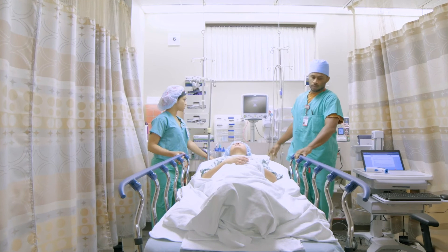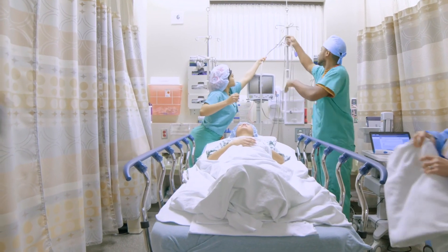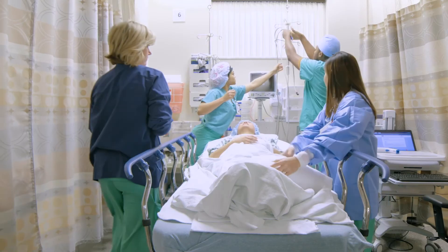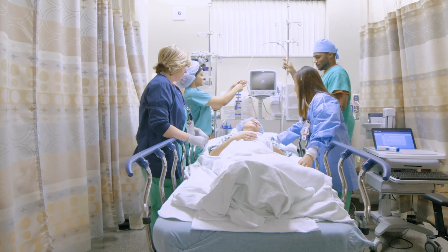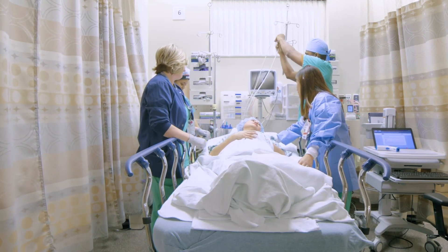In the procedure room, you will have your blood pressure, pulse, and other vitals checked. For safety purposes, you may be asked many of the same questions you've been asked before, specifically verifying the procedure and its location, your allergies, and your medications. Port removal is generally performed under moderate or twilight sedation, where you're sleepy or relaxed but able to respond to your physician and breathe on your own. Your physician will also discuss your personal sedation needs and ensure you're comfortable during the procedure.